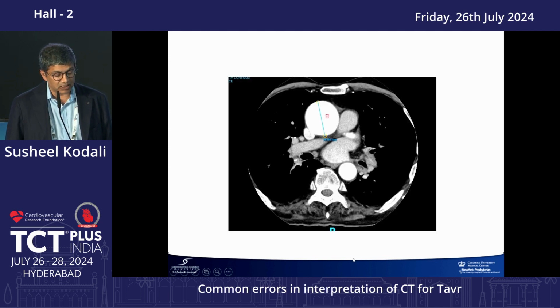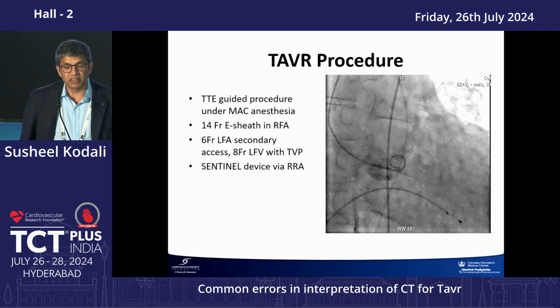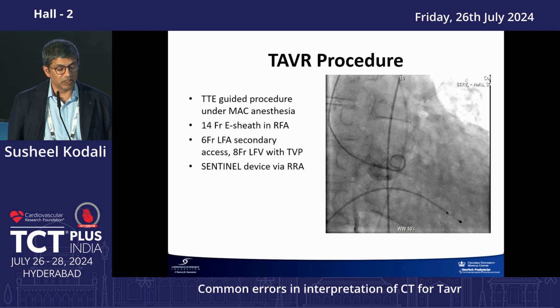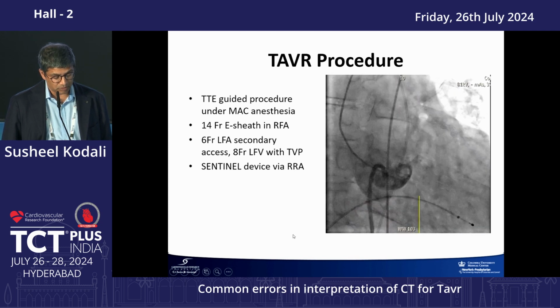The aorta is a little bit big, it's at 5. So the question is, is this a procedure that can be done? Yes, but understanding the risk, what you're doing, and how you're doing it. This is a patient that in general we would do asleep, although this case was done awake because the patient was high risk for going to sleep because it's complex anatomy. And so you see it's a big root.